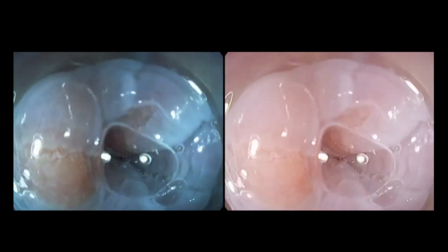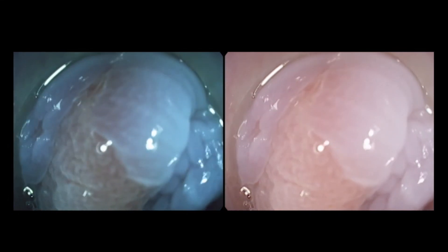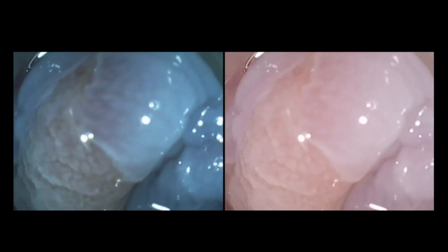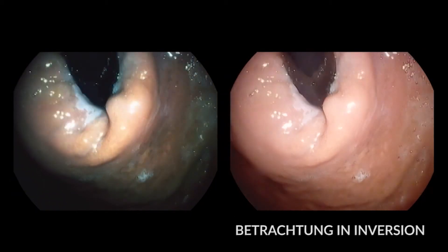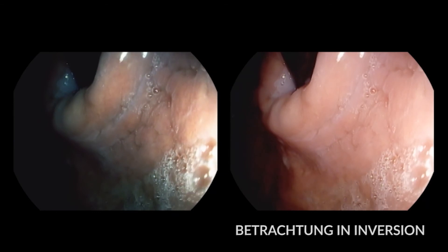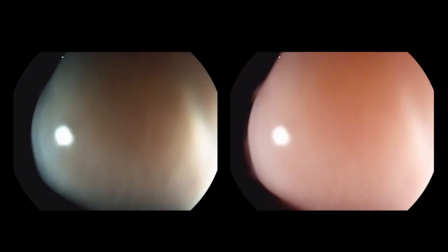Macroscopically, the rest of the Z-line has a gastric mucosa on it. Complete examination of the Z-line includes visualizing it in the inverted position. The Z-line is relatively low here.